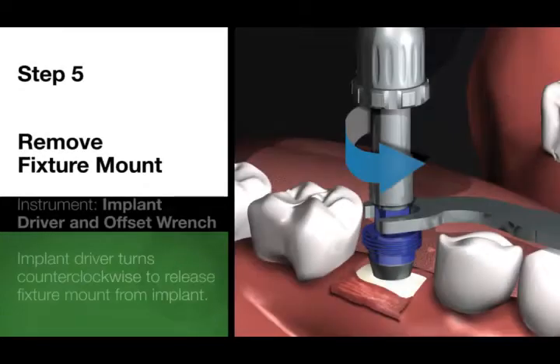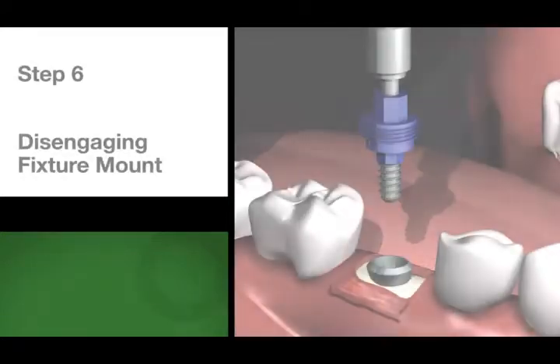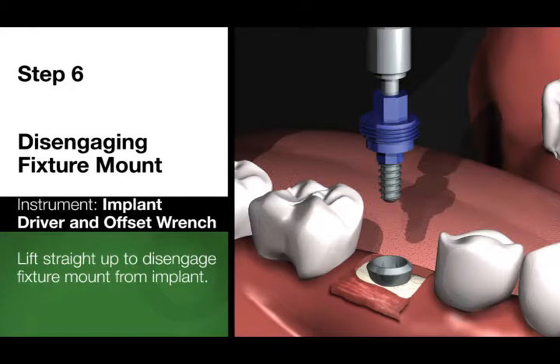Step 5. Using the ratchet or contra-angle driver tool with the holding key in place, turn the fixture mount screw counterclockwise to release the fixture mount from the top of the implant. Step 6. Disengage the fixture mount from the implant by pulling the driver tool and fixture mount away from the implant site in a straight upward or downward direction.